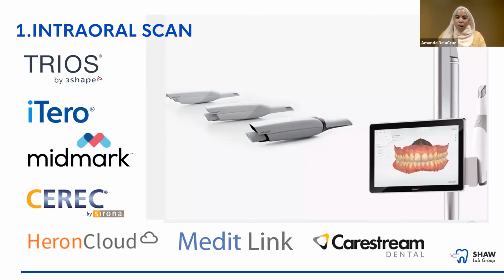It's not a problem. We create our restorations based off of these intraoral scans. It's the best way, it's the most accurate. If we can't, we produce our models in-house, and then we can convert those produced models back into a digital format to work off, just in case the bite is off and we have to check it, or if we have to reduce the prep or reduce the opposing. Those are the times that we would bring it back in after printing it.